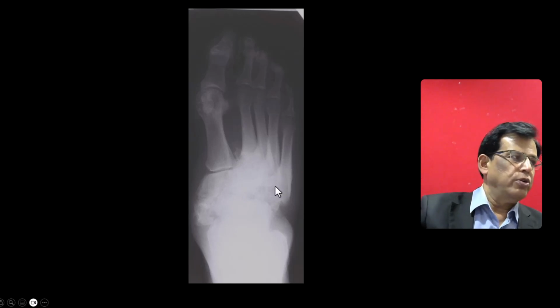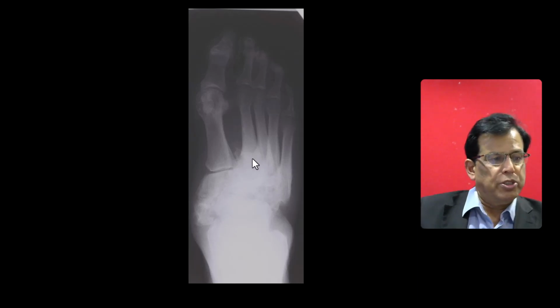The STIR is a good imaging modality. T1 and STIR are very good basic imaging to work out the infection. Diabetic foot requests are so common that you get so many, you can't give contrast in all, unless you really want to see some abscess cavities, or you can still look on the STIR image. Yeah, so that was good.